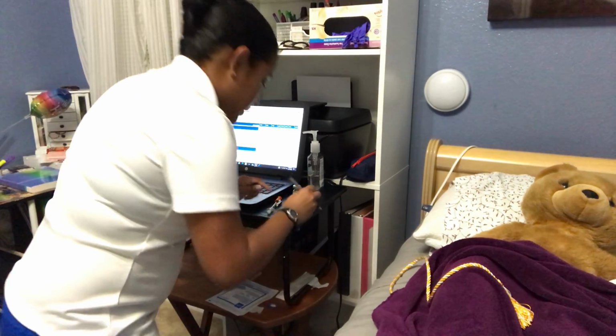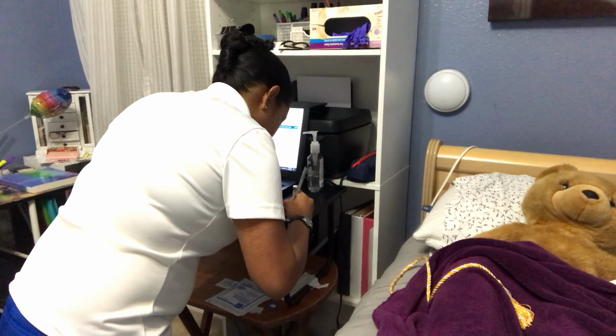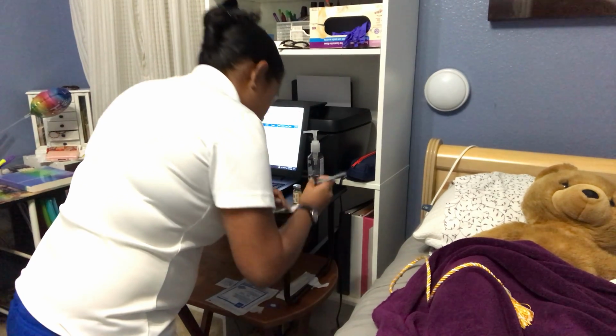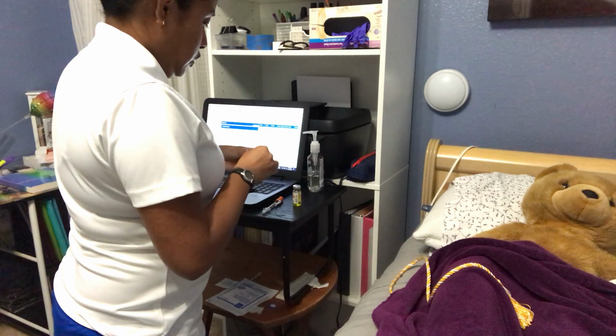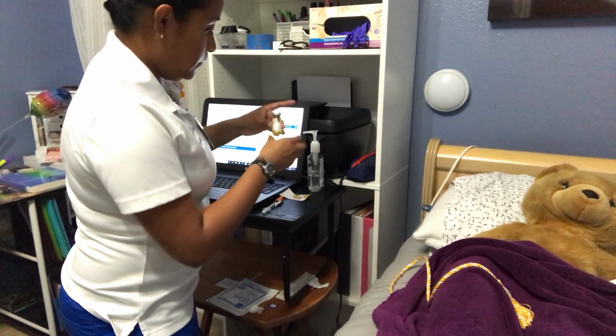Next I'm going to put the time, which is 1900, the day 11/11/2020, and my initials when it was last opened, since it is a new vial, I'm going to have to do that, and I put it on the container.